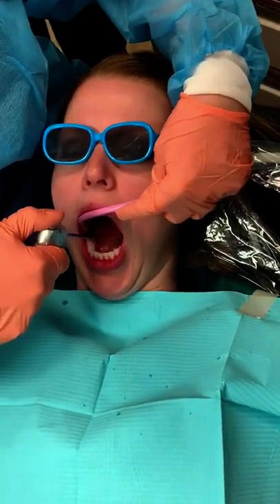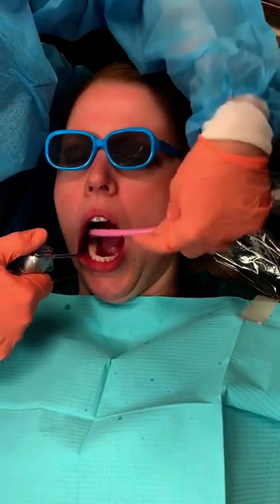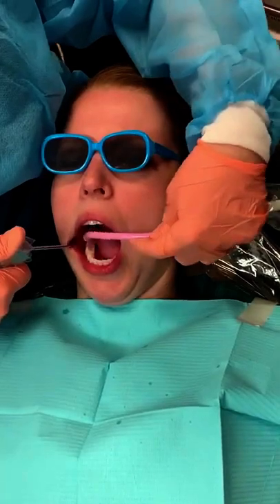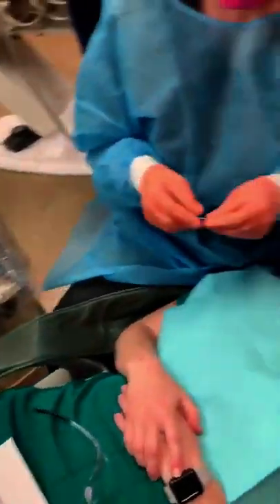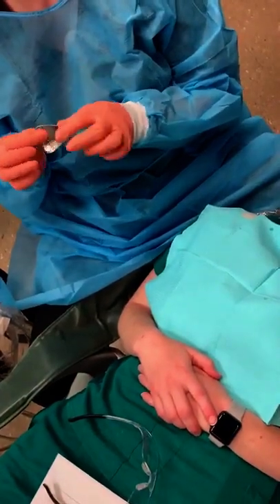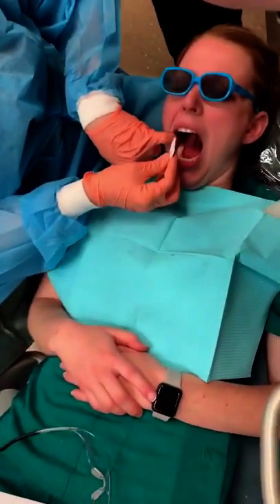Mix it off thoroughly. And now you want to place your isolation. We're going to use a dry angle to cover the parotid gland. If it has a silver side — some of them don't have silver sides, they're white and white — but if there is a silver side, it goes towards the inside of the mouth. The white goes towards the cheek.